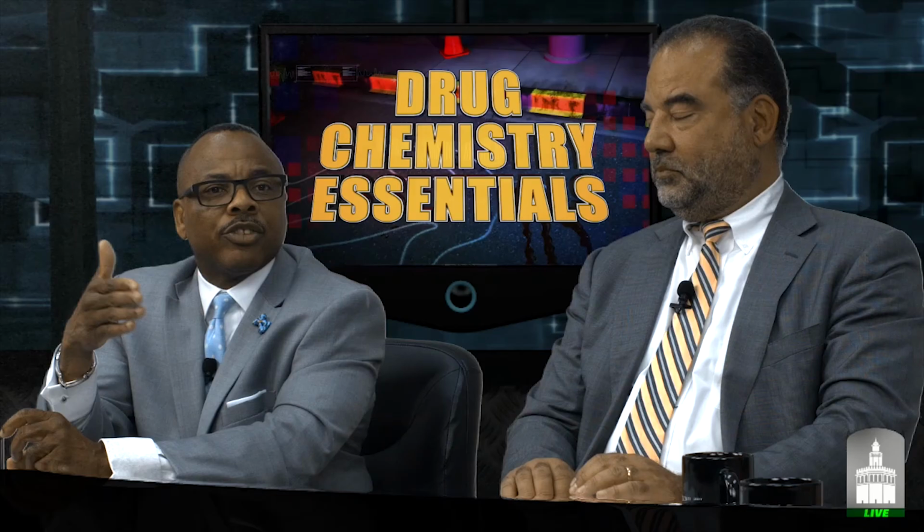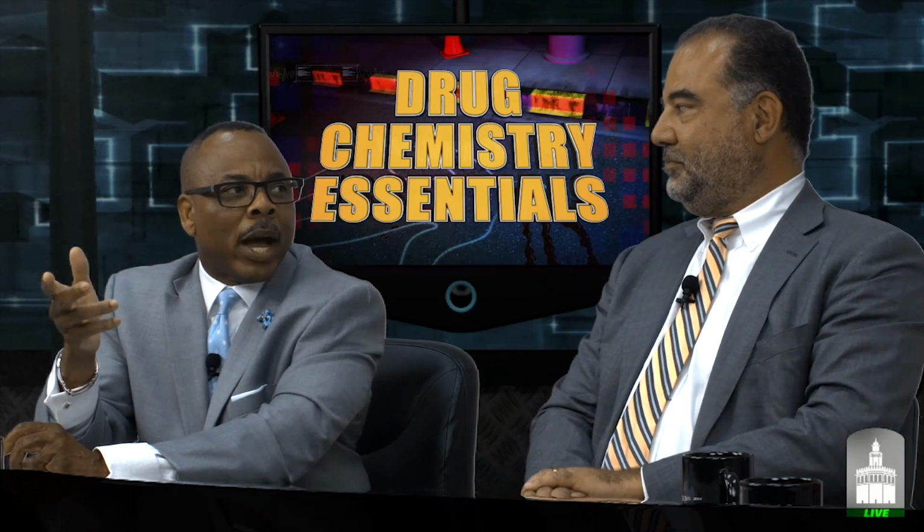And this is where the expert should be able to answer the question: has your method been validated? Is your method reliable? Is it based on an international standard? Does it fulfill minimum requirements for analysis? And as they're answering that question, ask them why. Why has it been validated?